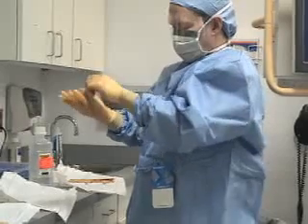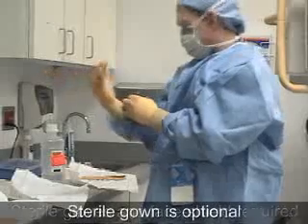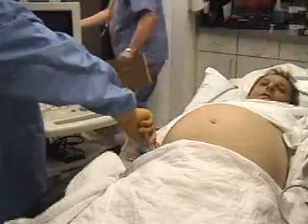Paracentesis is a sterile procedure. Sterile gloves and a face shield are required. The use of a sterile gown is optional. Prepare the site with an antiseptic solution and then apply a sterile drape.